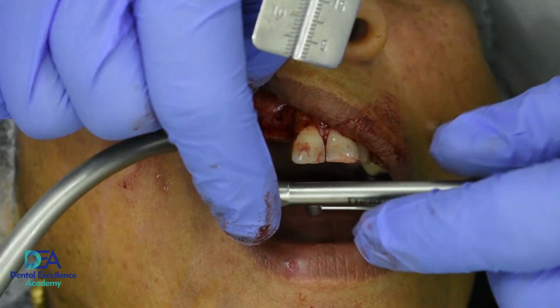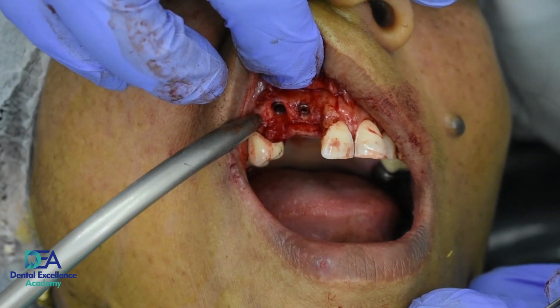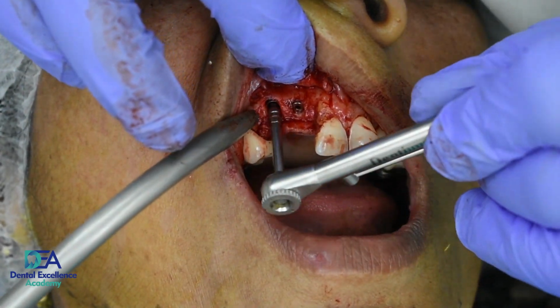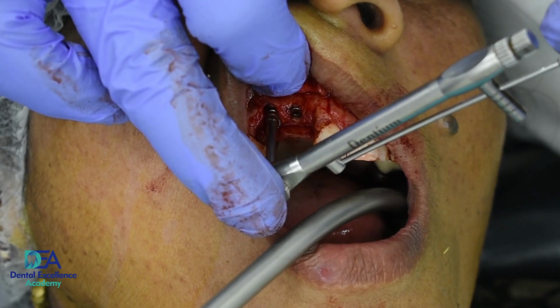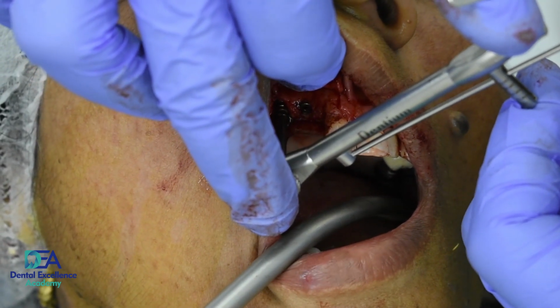If you are doing a guided one, you can have a predetermined parallelism, but clinically you have to check intraorally that you are parallel to the adjacent tooth.